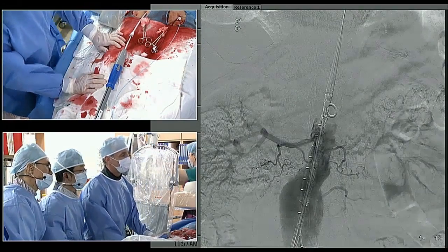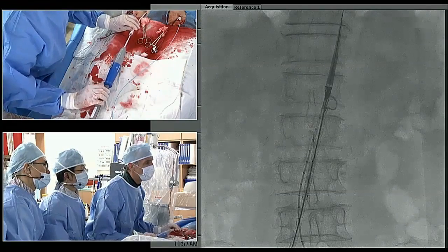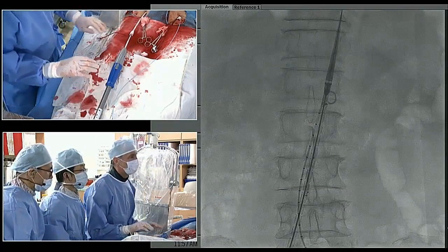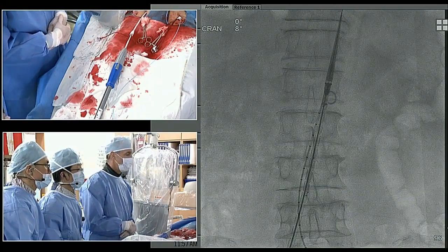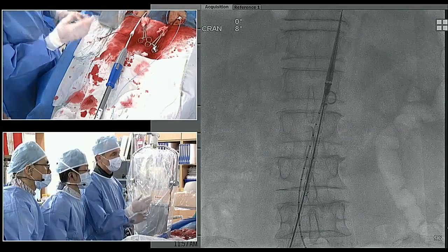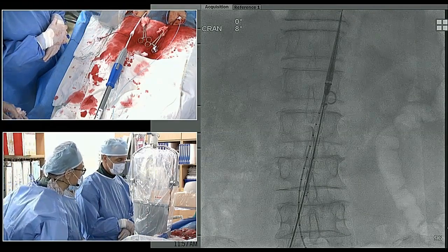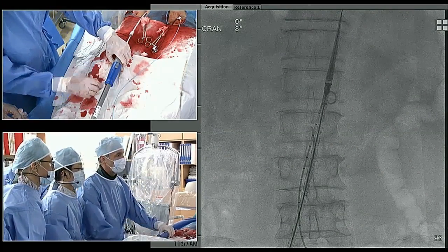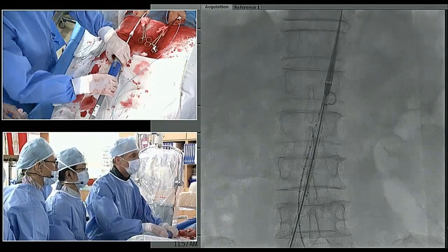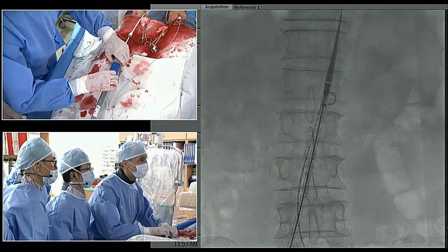Okay. Now I'm going to do live fluoro, and you can see at the bottom, I've got the contralateral limb markers on the left side. Yes. So as opposed to the other case which flipped them, we're going to keep them fairly standard. Good. I would agree with that. Okay? So the first thing to do is we're going to start to deploy this, and then we'll do our final positioning after we get a couple of wire forms out.